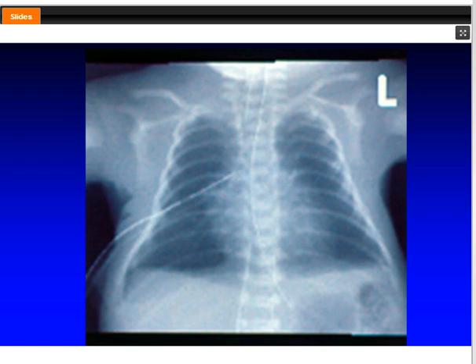So what's wrong with this patient? Well, this patient was left on 15 hertz because that's what worked early on. But as the lung disease changed, this patient has gotten into more trouble, and no one bothered to wean the mean airway pressure on this baby. And this baby got very overinflated, and as you can see, wound up with a pneumothorax. So as I try to tell people, if all else fails, try examining the patient.